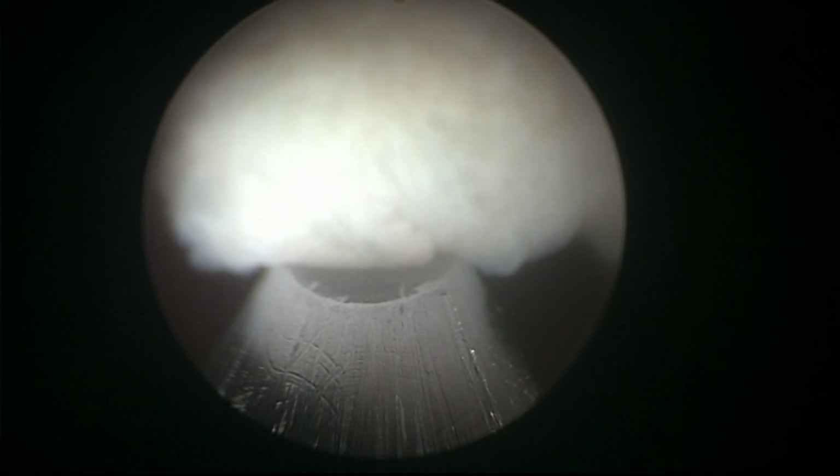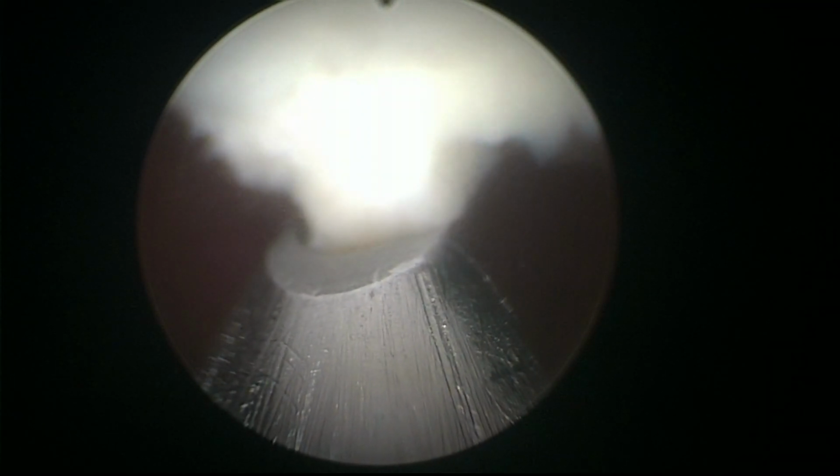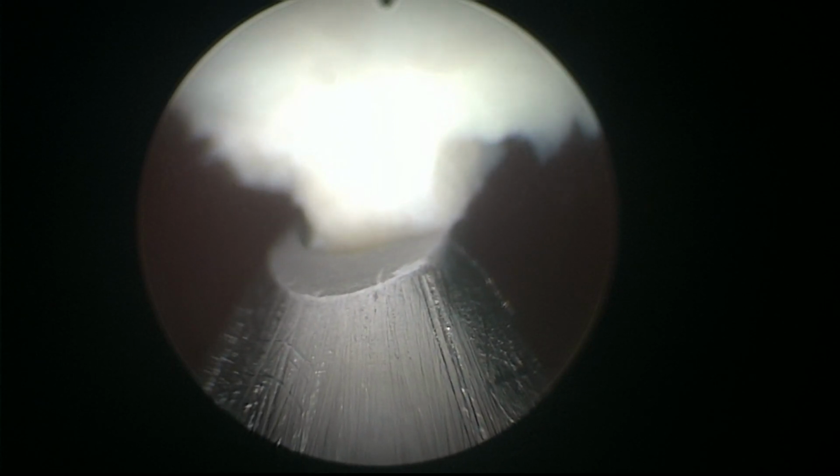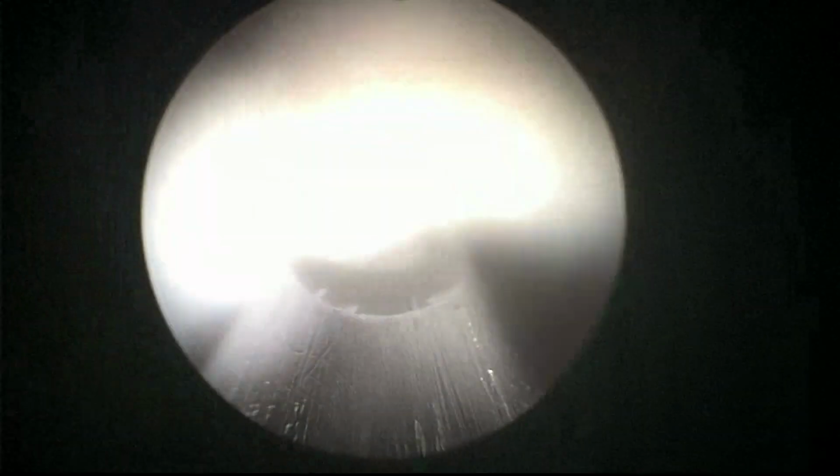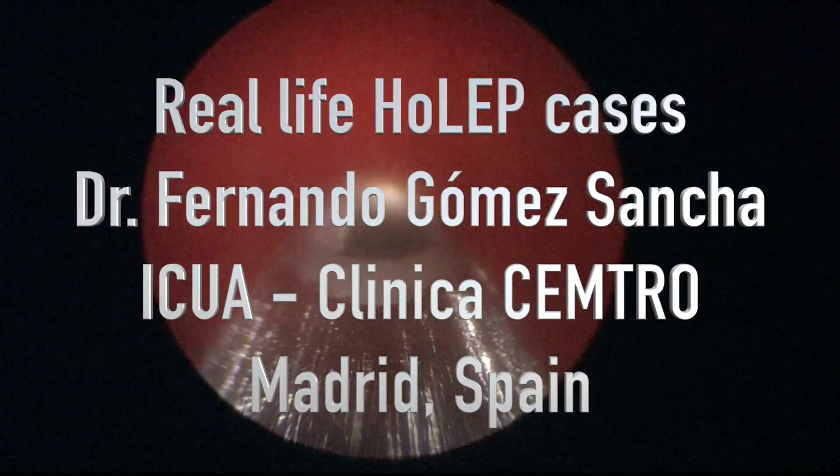With the Piranha morcellator, morcellation is usually very fast, and even stopping a little bit to fill the bladder, it is a quite fast procedure, and I prefer that to having 2 inflows, which is a nuisance, 4 bags, 2 giving sets. And here, probably I was waiting a little bit. Sometimes the bladders are not so big, and they fill very fast, and they empty very fast. And that's the end of the procedure.